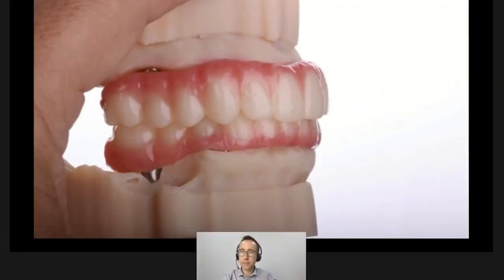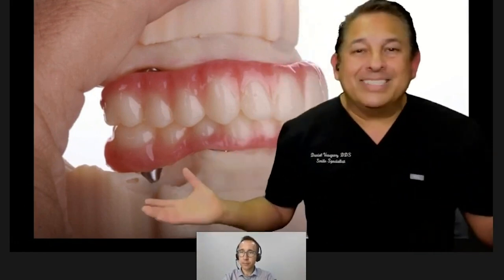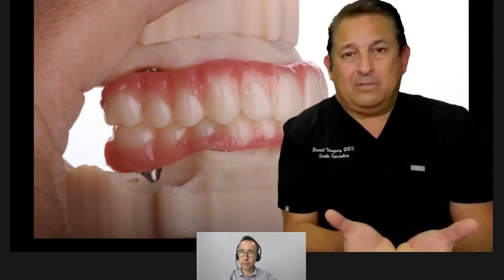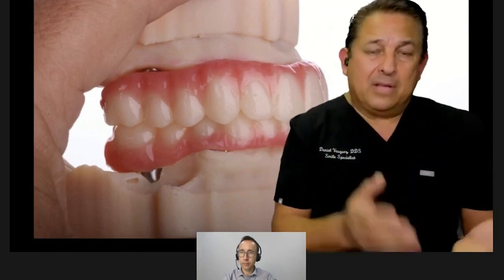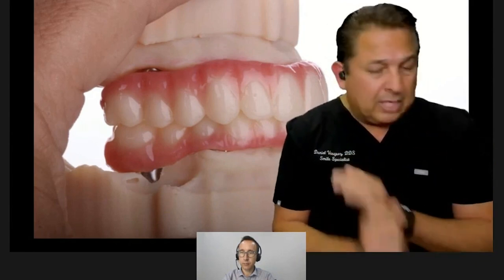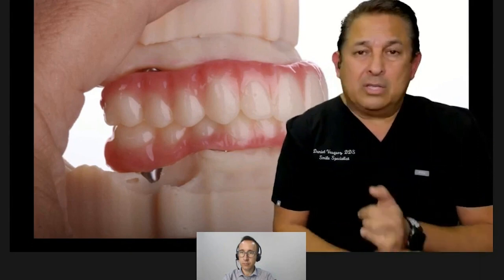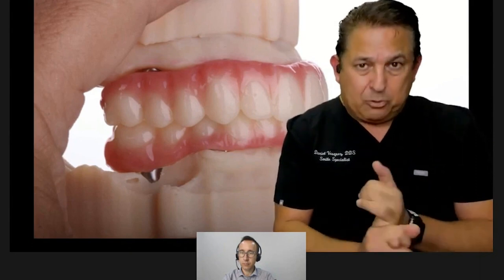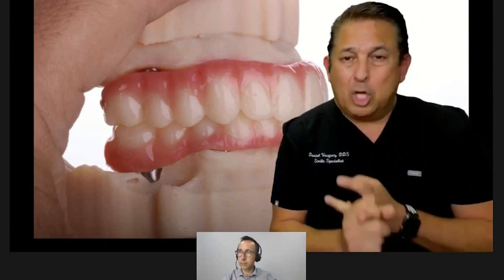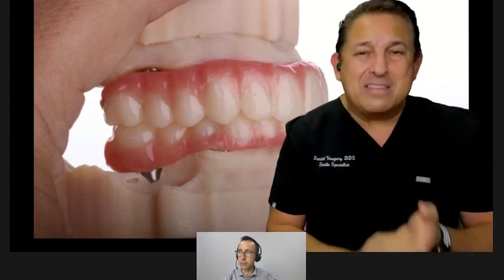Printed models, printed teeth. Everything is printed, okay? There's no reason to have a physical model. If you have a Primescan and you're still taking impressions, you're doing it wrong. You're doing everything wrong. There's nothing better than a Primescan impression. Trios impression, Medit impressions, all these devices take phenomenal impressions.